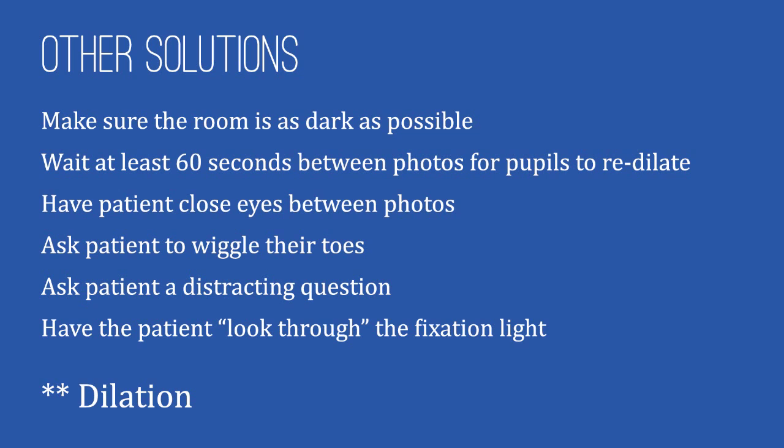Ask the patient to wiggle their toes, which may seem silly, but it does help dilate the pupil a little. Another trick is to ask the patient what they will be doing later in the day, for instance, what they plan to make for dinner. This tends to cause the patient to lose focus, which can make the pupil dilate as well. Have the patient look through their fixation light as if they are looking at the wall behind you.